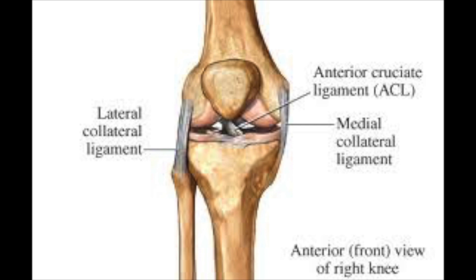In this procedure we're looking to help stabilize either the lateral collateral ligament or the medial collateral ligament of the knee. This taping procedure is basically the exact same for either side — we'll demonstrate a lateral just for the ease of viewing. It can help in sports where having a substantially sized brace may not work. We utilize this with wrestling quite a bit, or if the person just doesn't feel comfortable in a brace of that size.